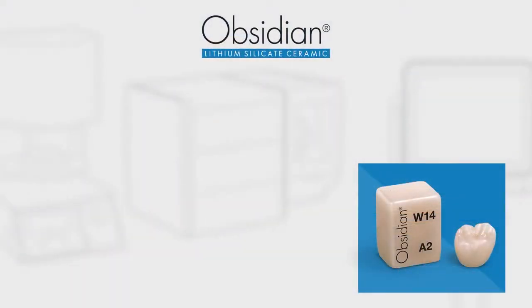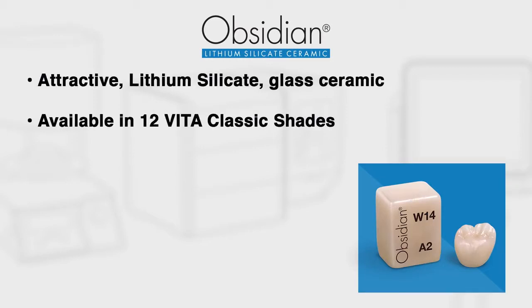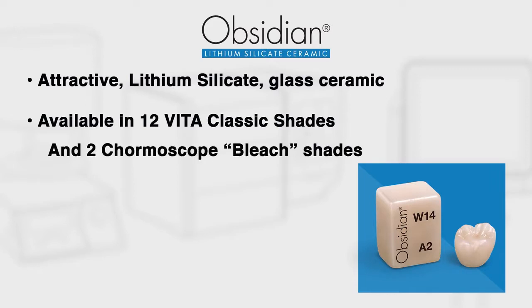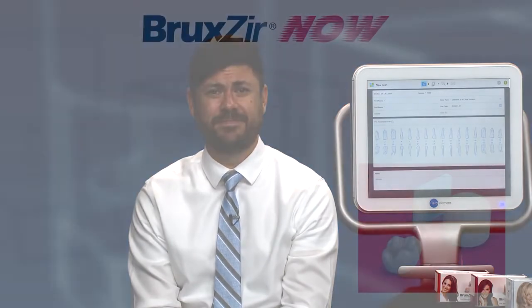Let's take a look at the variety of materials our doctors can choose to work with on the FastMill.io chairside mill. First, Obsidian Classic. Obsidian Classic is an attractive lithium silicate glass ceramic material that comes in 12 Vita Classic shades and 2 Chromoscope bleach shades and packed 5 per case. The burr should be changed after every 5th restoration.